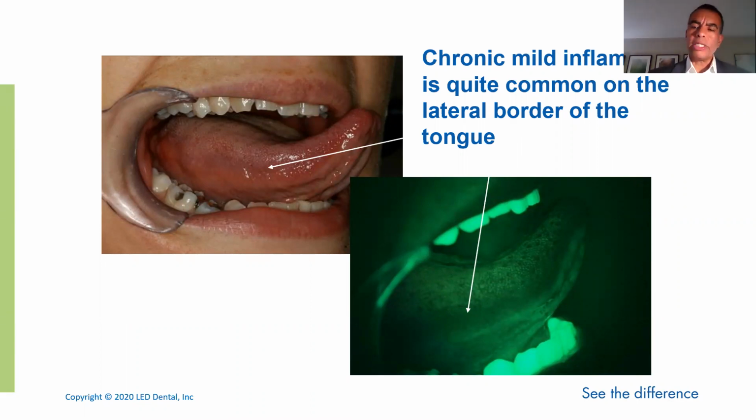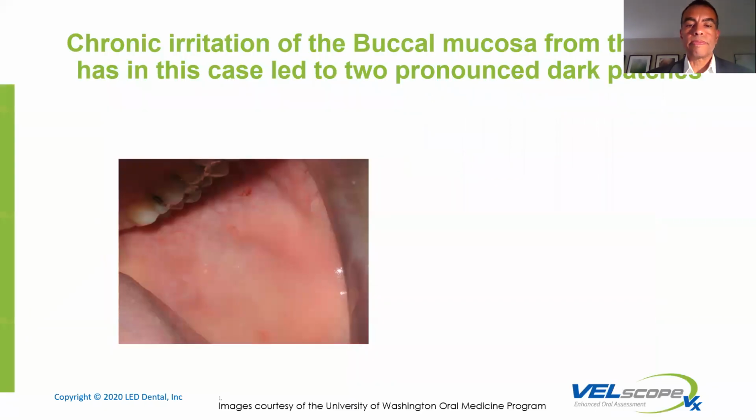So think about if we see this irritation, let's not just blanch it and say, oh, it turns green, so it's not cancer. What can we do to resolve whatever is causing that? And then think about those steps. And again, it provides a great opportunity for you to sell, if you will, or offer your products. And I say sell meaning sell on your treatment protocols or benefits, but then also obviously it's a benefit to the patient by eliminating that irritation.